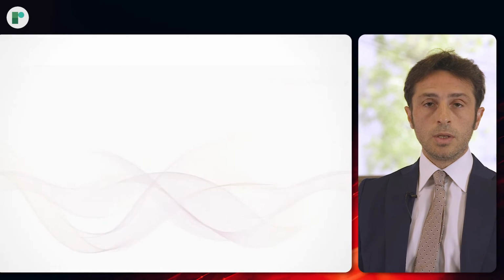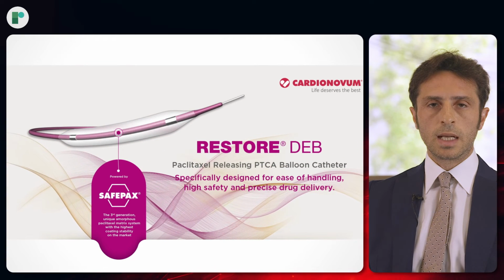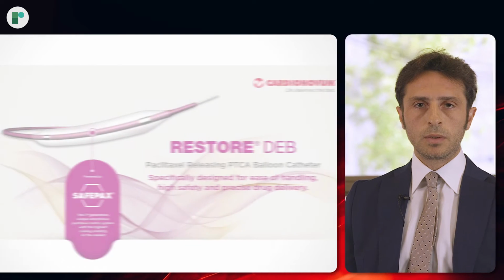The DCB used for the study was the RESTORE paclitaxel-eluting balloon, which is a new generation device which has an amorphous coating made of shellac ammonium salt, which is hydrophobic during tracking and lipophilic during inflation. It means that wash-off of microparticles should be minimized compared to other DCB currently available on the market. DES used were of different brands according to operators' discretion.